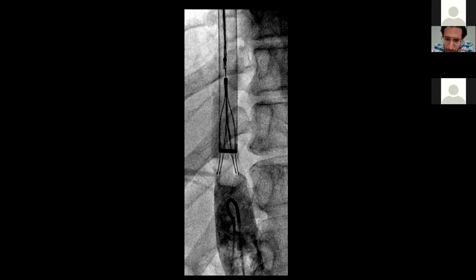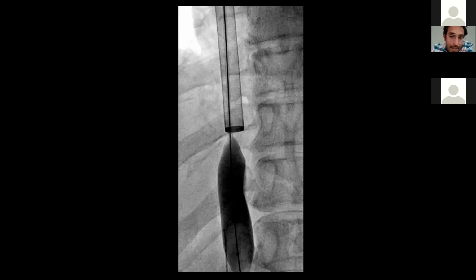It's always funny the answers I get, but most people say actually go for it. So that's what I did. And surprisingly, the filter came out, the clot didn't, but the clot didn't move. So that was a scenario that I wasn't really expecting was possible or that would happen. But at the time we were in the EP lab and didn't have much available to us. So I tried doing a balloon here.